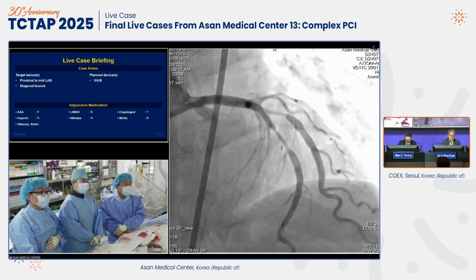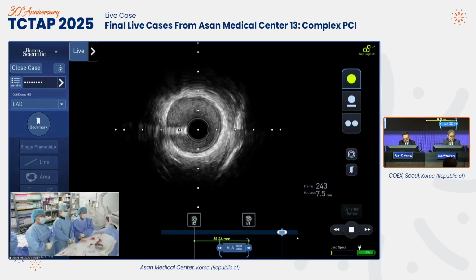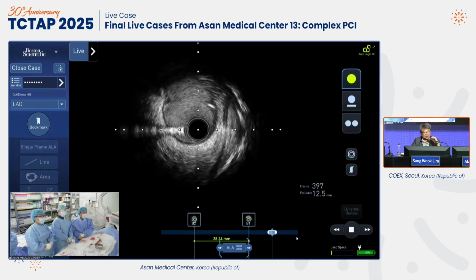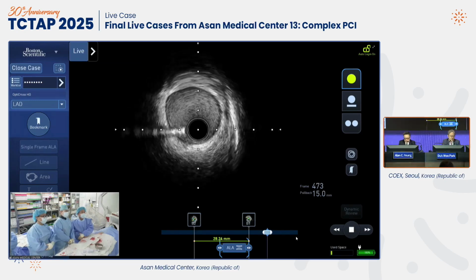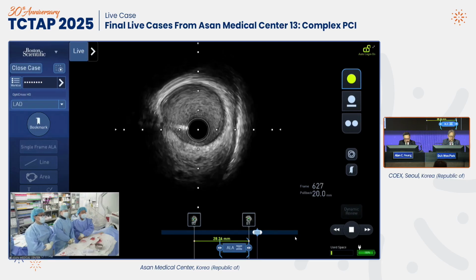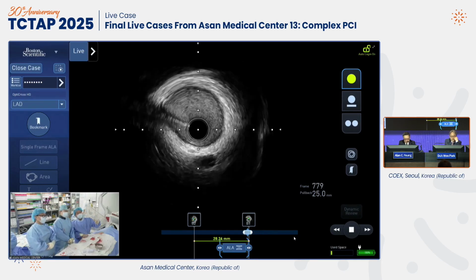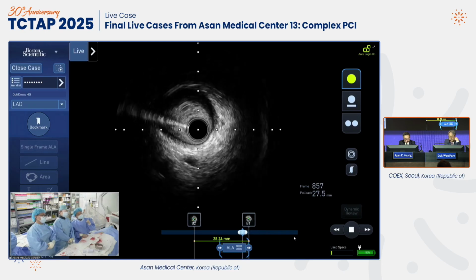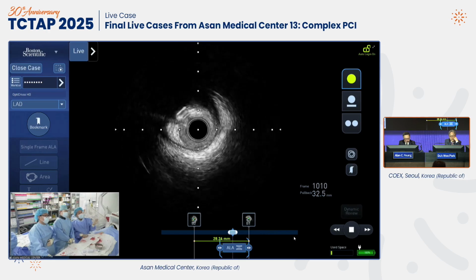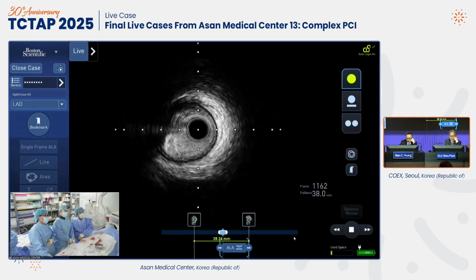Okay. This is already obvious. To stent the diagonal, first diagonal. This is the LAD IVUS. So what type of stent technique is the question. This is the LAD pullback IVUS. 3 and 3.5 vessel size, normal looking area, just the distal part of the region, right? Yes. And discrete narrowing. Very tight. This is pretty much plaque and not too much calcium, but relatively soft plaques.